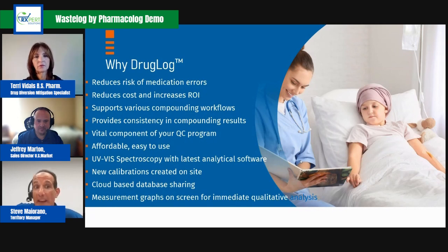So you don't want to be walking in there with controlled substances to actually perform your waste log testing, and you don't want to take the DrugLog out of the sterile area to perform that. So there's various reasons why, and they're set up differently software-wise as well. Because again, one is for waste screening, where the other is for verification of the product prior to it going to a patient.